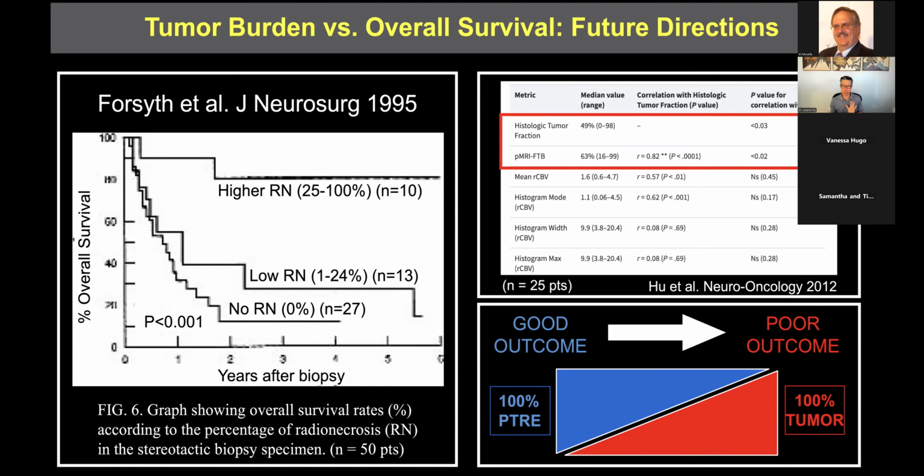So I think the next steps of what we need to really consider are incorporating techniques like FTB or any other techniques that can quantify tumor abundance, put them into large-scale multi-institutional clinical trials where we are controlling treatment arms to make those uniform, where we are consistently getting very good clinical annotations of treatment outcomes, and really make sure that we level the playing field and assess in a very objective manner where FTB or other techniques fit into prognostication.